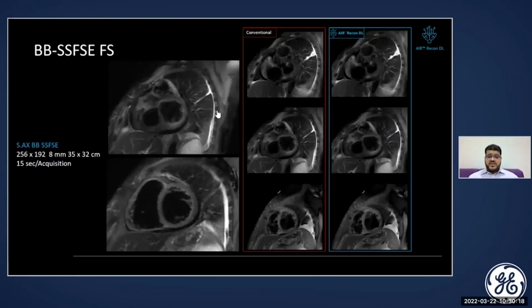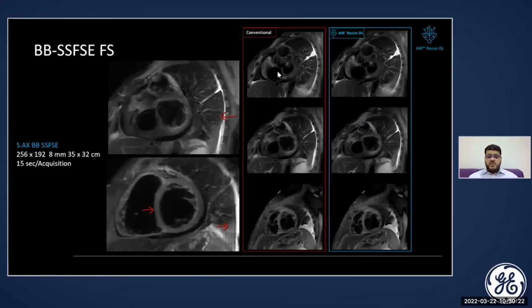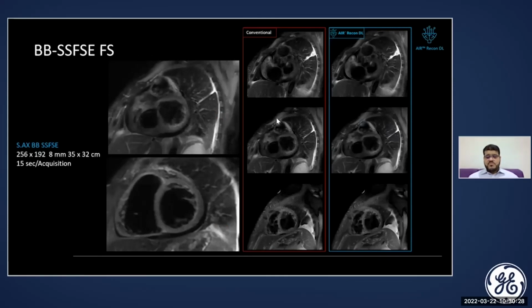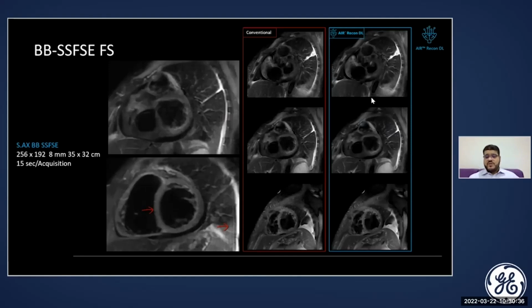These are the edema images, and as you can see here, the qualitative assessment of edema did not demonstrate any evidence of edema. We have some issue with signal to noise ratio that improved significantly when we apply the new technologies now at the disposal of the imagers.